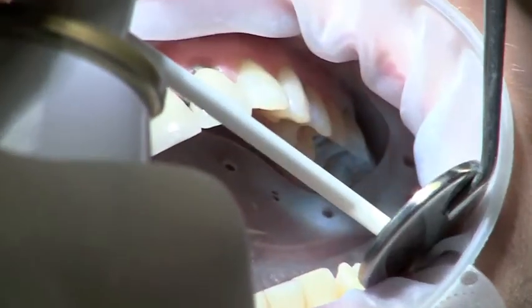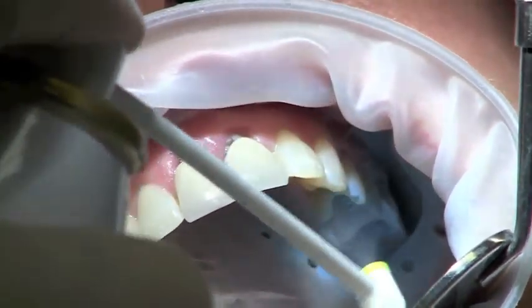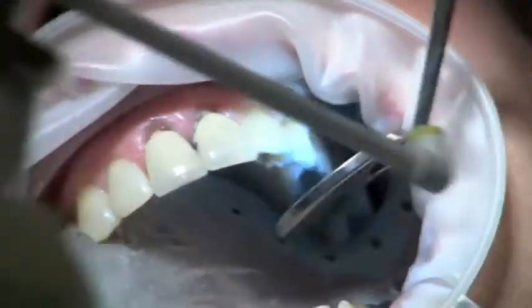I want my reflective medium to be applied fairly rapidly. I want it to be smooth. I don't want boulders on the margins. I want to be able to dry it. My basic technique with contrast spray — and also the Vita powder spray — but I'm starting to lean more toward the contrast spray. I did like the Vita powder when it first came out and I hadn't tried the new contrast spray since that's been released.